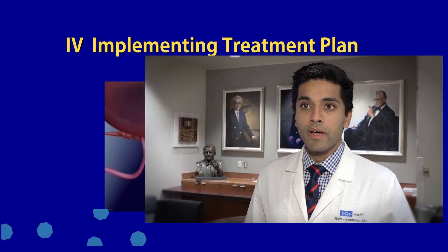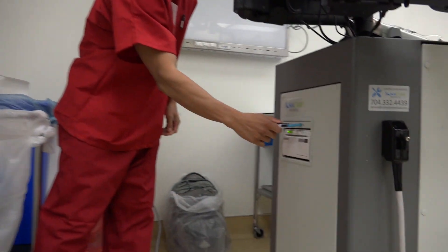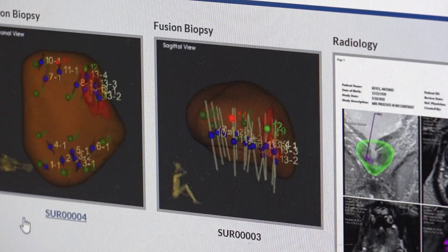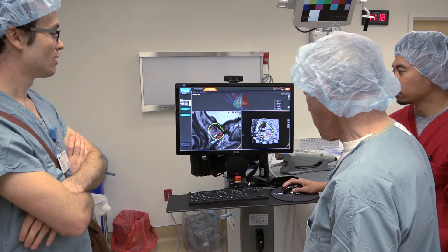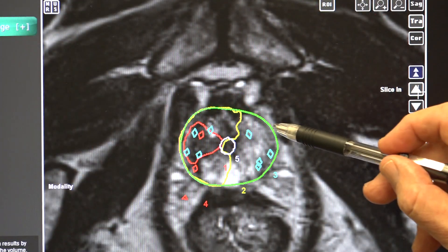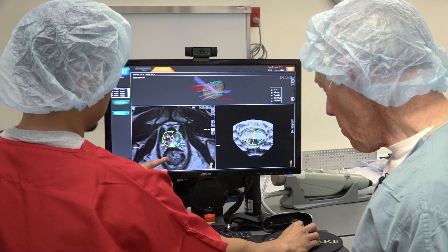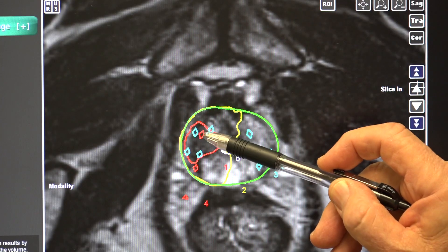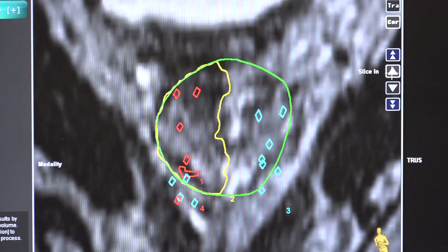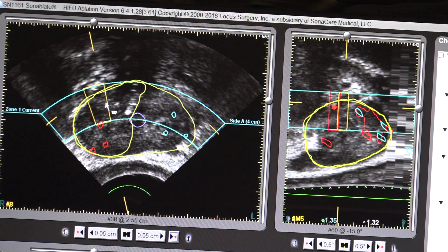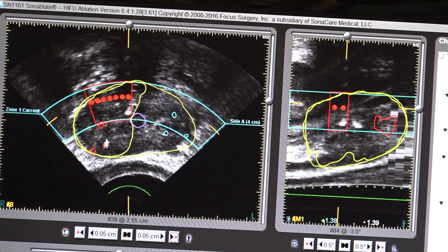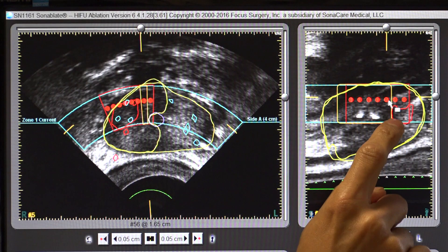Using a recently approved device as a treatment model, the plan is then entered into the HIFU device for targeted ablation. After visualizing the prostate with ultrasound and segmenting it within the treatment device, the plan is then fused with real-time images. At that point, the treating physician applies clinical judgment to determine the actual limits of ablation, balancing the desired cancer control against the potential adverse effects of margin extension. For example, the urethra may be excluded from the ablation zone if so desired. Having imported the treatment plan, focal ablation of the cancer then proceeds according to that plan, and could be via HIFU, cryotherapy, or even laser ablation.